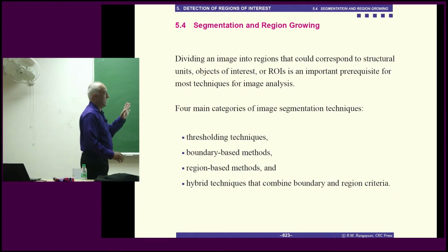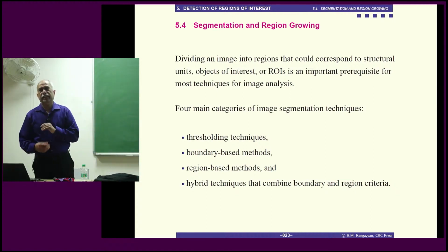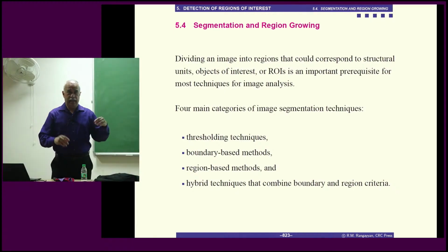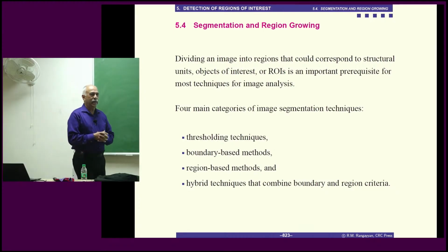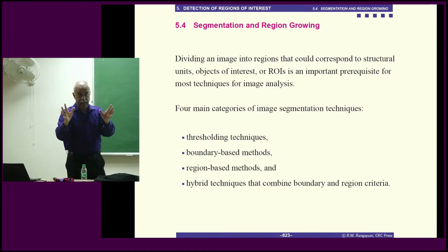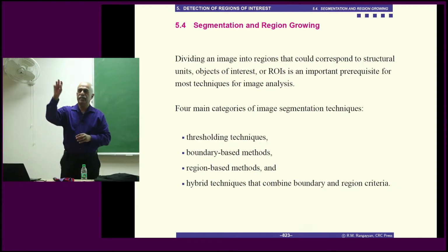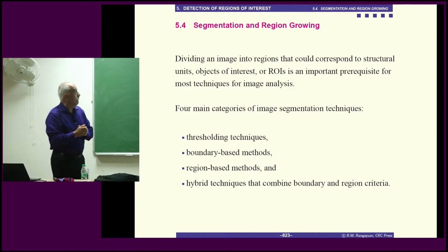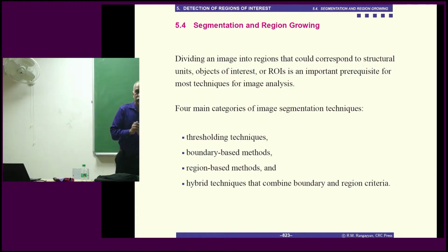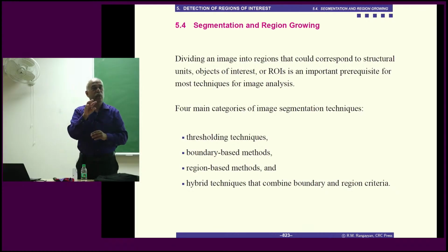So that is edge detection and edge analysis. Quite often, edge detection and analysis will give you broken edges, and this edge linking may be a bit of a challenge. You may not be able to achieve good results by connecting these pieces. It's a bunch of dots, and you connect this, so you throw that out. The final result, it may be hard to say this is a tumor, this is a calcification, this is something. Whereas segmentation by region growing perhaps will give you connected pixels and possibly a closed region, maybe even a compact region. Compact meaning no holes inside.